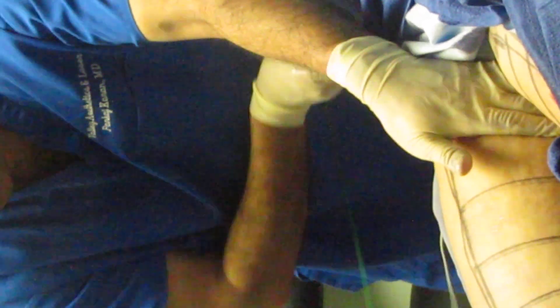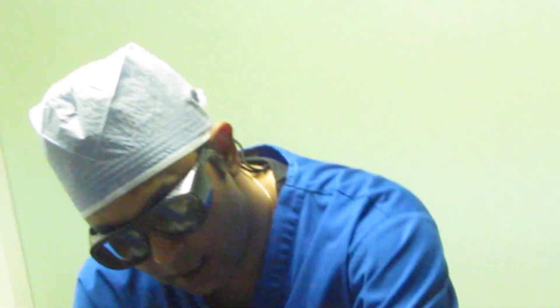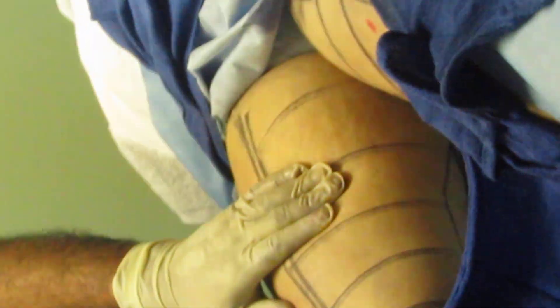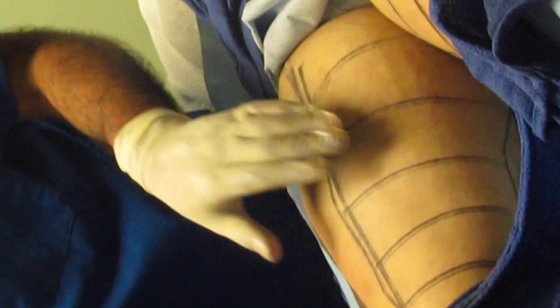This is where the maximum amount of bulges are, and the approach here — the upper approach — is very important so that we can melt all these fat cells. This bulge has got to be gone, and this approach here will take care of it.